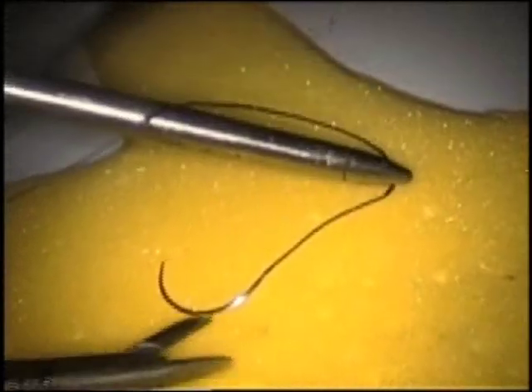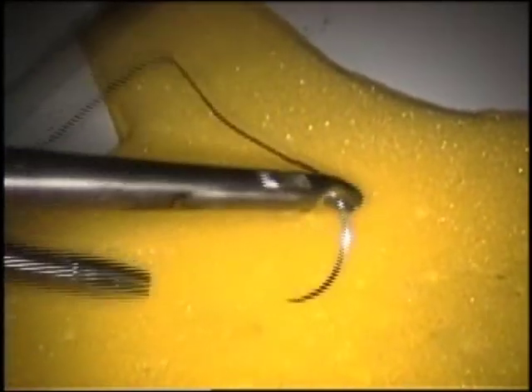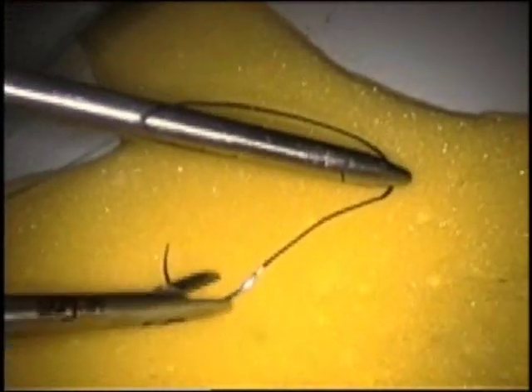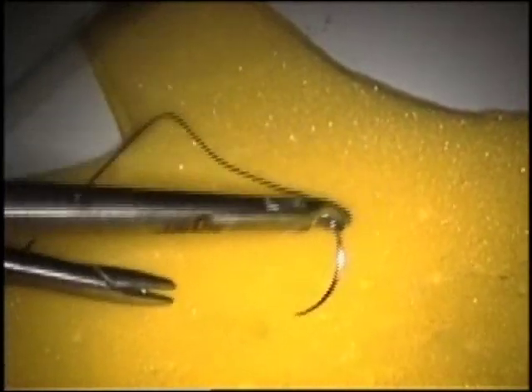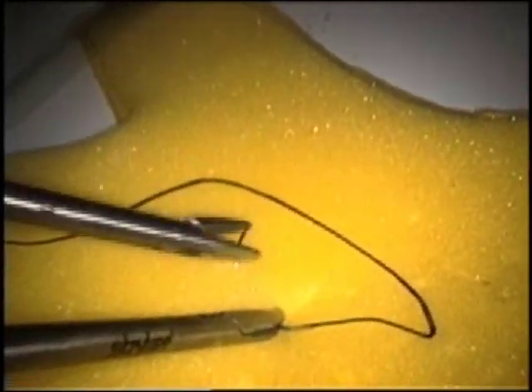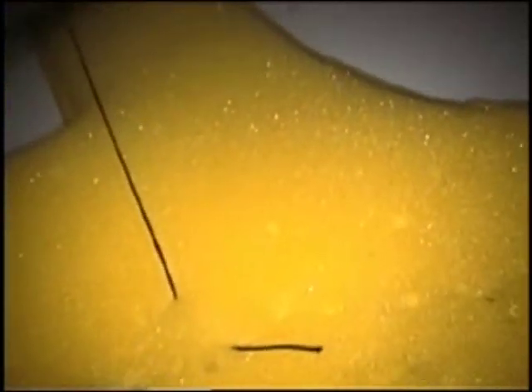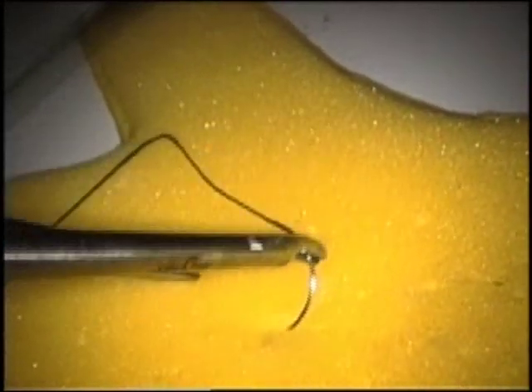The next step is tissue penetration. As in the open arena, the needle should enter the tissue at a 60 to 75 degree angle. The needle is then rotated through the tissue following the curve of the needle. Use of axial needle drivers such as the Ethicon German needle drivers facilitates this step. The non-dominant hand can help stabilize the tissue as the needle is rotating through. The tip of the needle is grasped as it emerges through the tissue with the non-dominant hand. This grasper should then be locked to prevent accidentally dropping the needle.